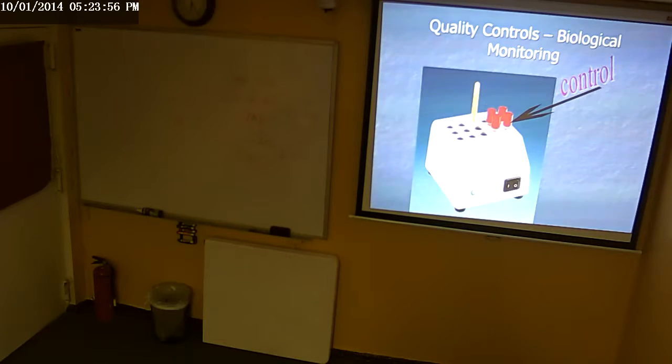Before you draw that conclusion, you're going to have to run another test. They come in a pot, so take another one and put it in there again. If it's also dead, now we have to find out which is which. You're going to look for another incubator and test it in there.